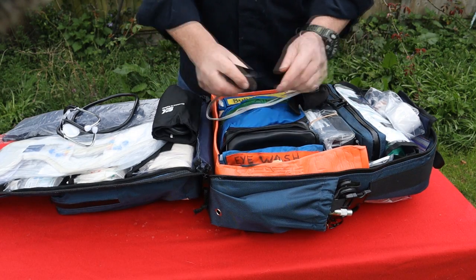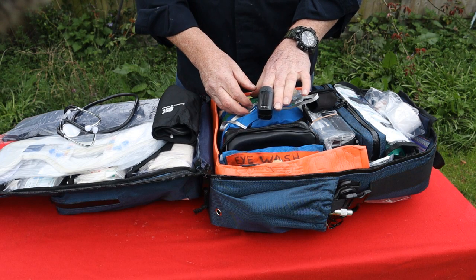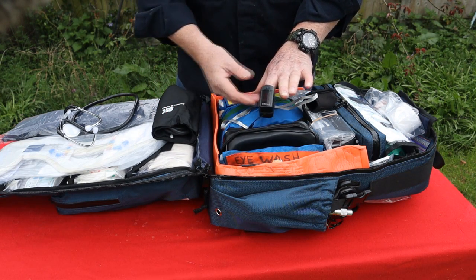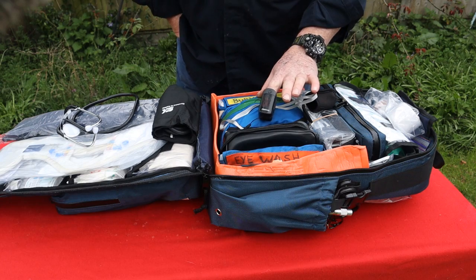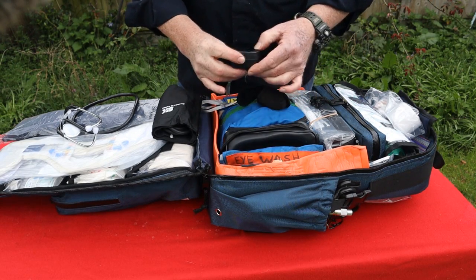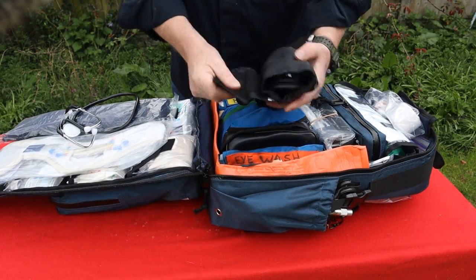This is a sort of an electric pulse oximeter. You literally just turn it on, put it on the patient's finger, and it gives you a constant oxygen content in the blood, and it should give you a constant pulse. So my pulse, oxygen content 97%, that's okay. Pulse 77, that's a bit high. 60 to 72 is somewhere near resting normal pulse. Great gadget, just put it on, forget about it. They cost next to nothing, so I think we're talking about 10 or 20 pounds for a pulse oximeter nowadays. BP cuff for taking blood pressure.